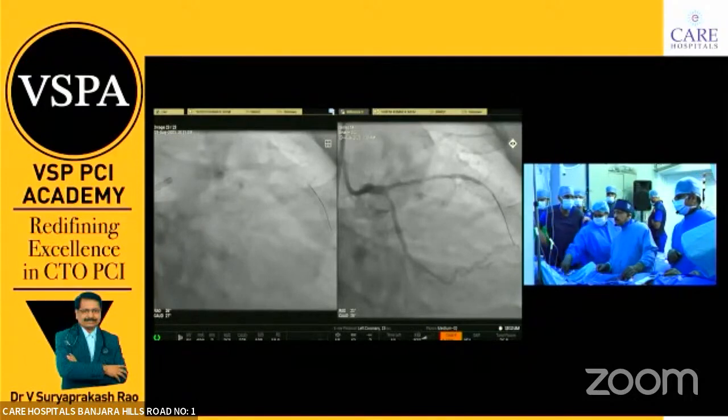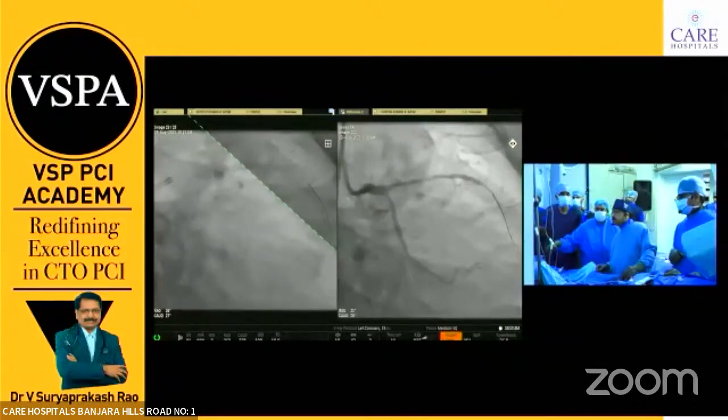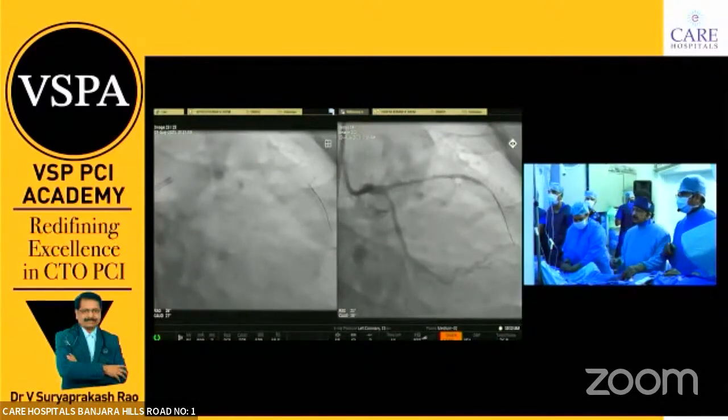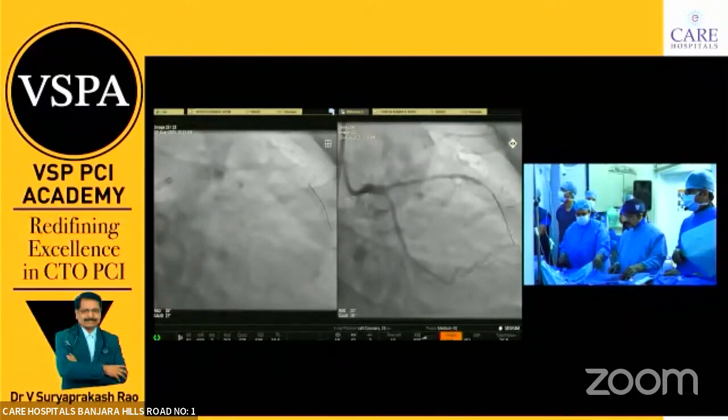What is the measurement of that? This area, is it in the lower stent? Ravi garu, is this area in the lower stent? Just use the same balloon, I'll go to 10 atmospheres. 4.5 is acceptable.